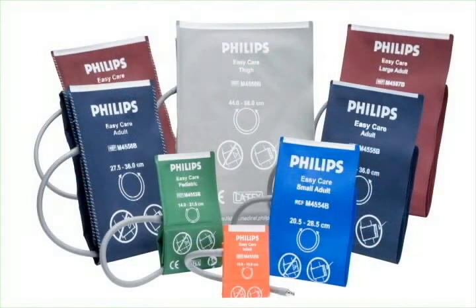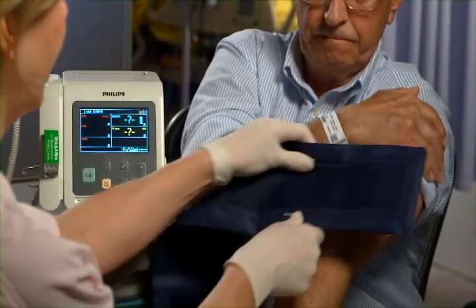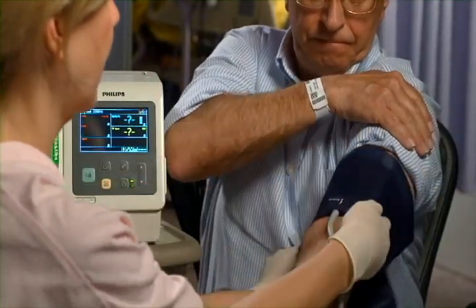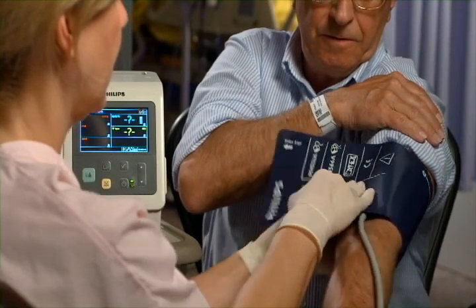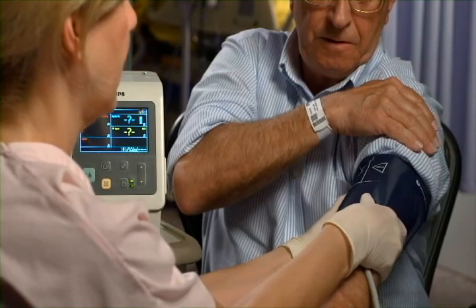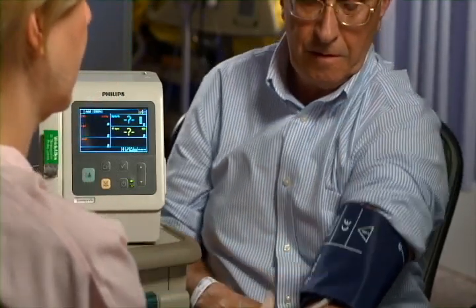When performing NBP, the first step is to select the appropriate size cuff. A properly sized cuff should span approximately two-thirds of the distance between the elbow and the shoulder and wrap around the limb. Use of an improperly sized cuff can result in inaccurate blood pressure readings.